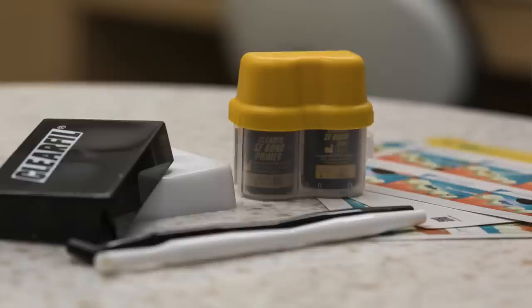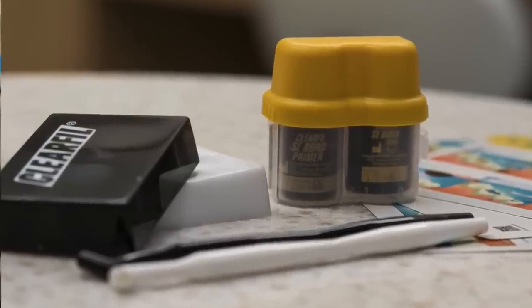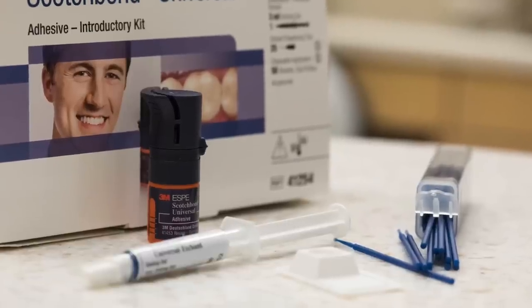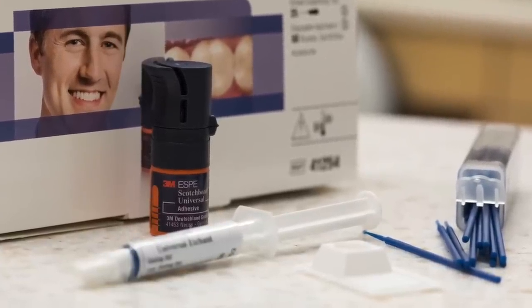Or you can use a two-step self-etching bonding agent — a sixth generation bonding agent — an example of that would be Clearfil SE. You could alternatively also use a universal bonding agent such as Scotch Bond Universal. There's a little bit of a difference between each of these bonding agents, and I'm going to go through one of these, but if you use one I don't cover, just refer to the handout.